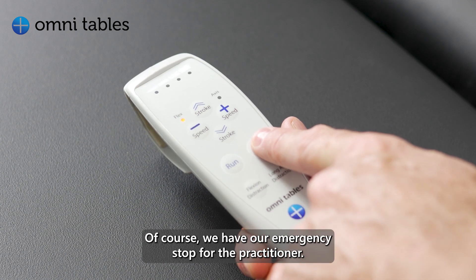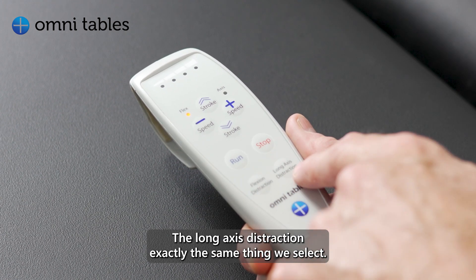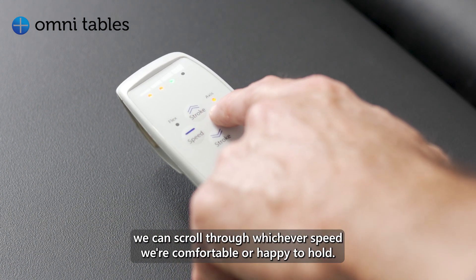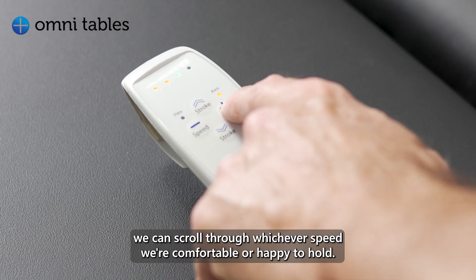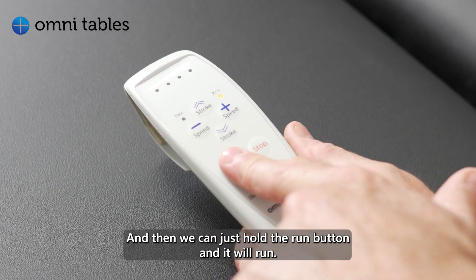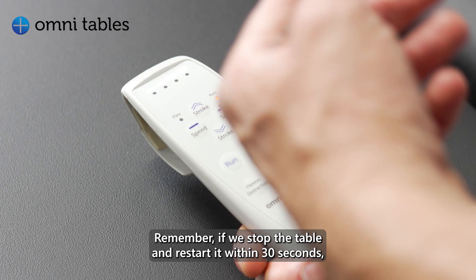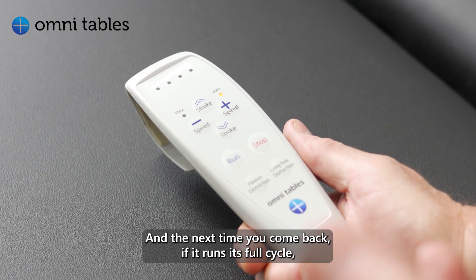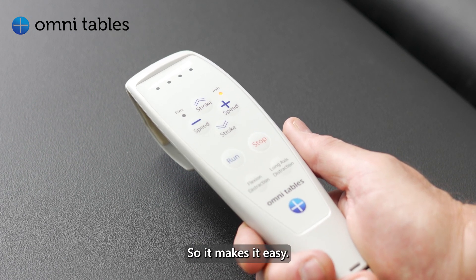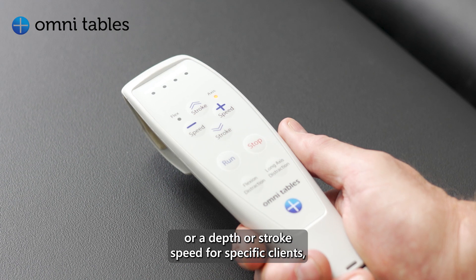We have our emergency stop for the practitioner and a separate handheld button for the client to immediately stop the table. For the long axis distraction, it's exactly the same — we select long axis, set the speed, scroll through to whichever speed we're comfortable with, then go to the stroke and bring it to where we're most comfortable, then hold the run button and it will run. Remember, if we stop the table and restart it within 30 seconds, it'll run at the previous settings. When it runs its full cycle, the table will commence at the last settings you had.